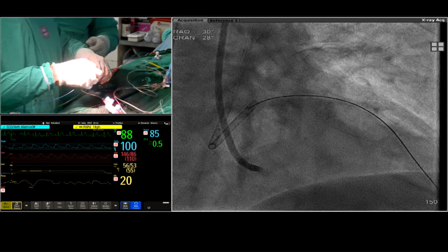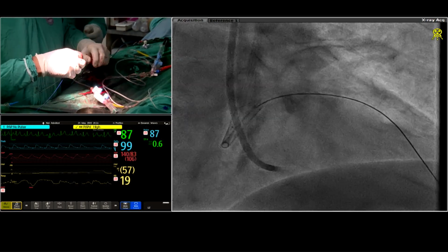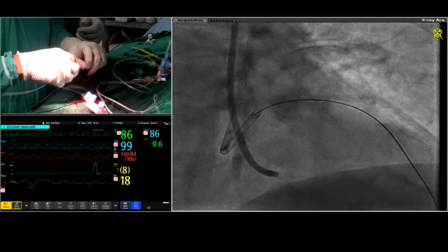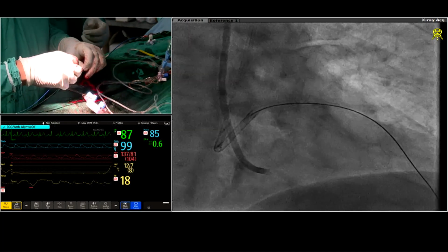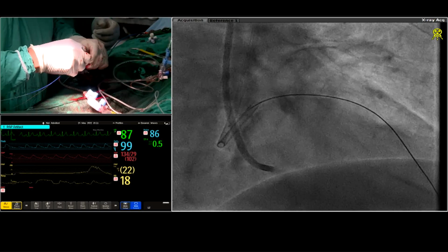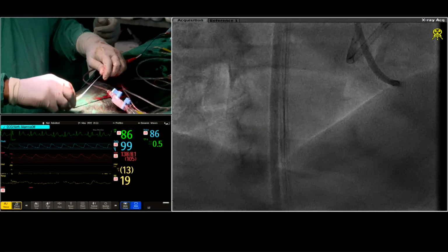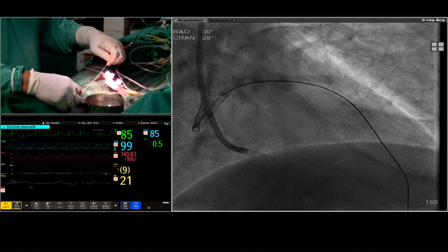Using dock extension for this. You can use dock extension, but to keep connecting it all the time and removing it, you sometimes bend the distal end, and there is a big problem. Once you have connected, keep it connected. Then the assistant will have a problem. Maneuvering becomes difficult. Fix. You should hold it actually. Okay. Detrap. Unlock.